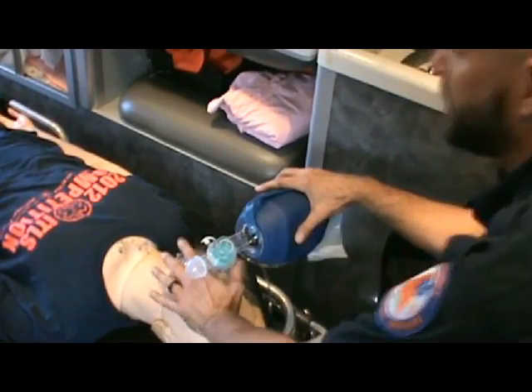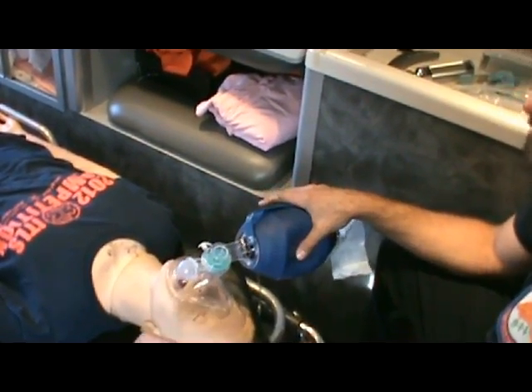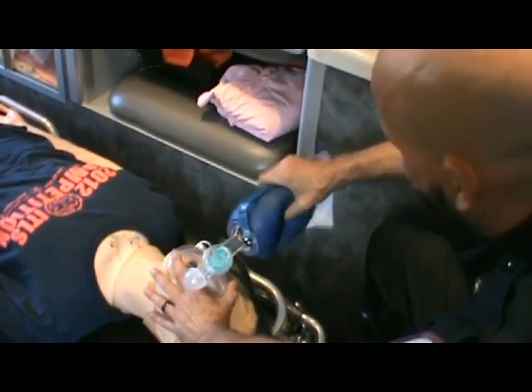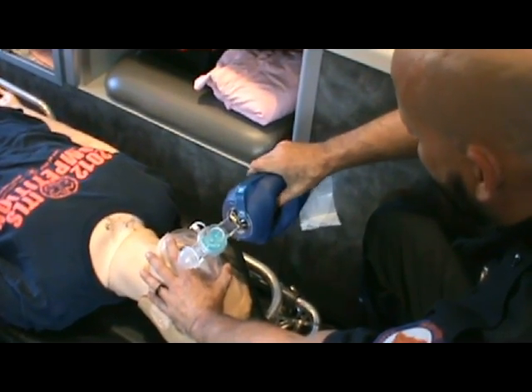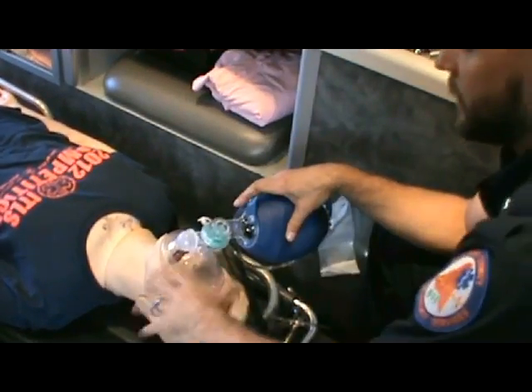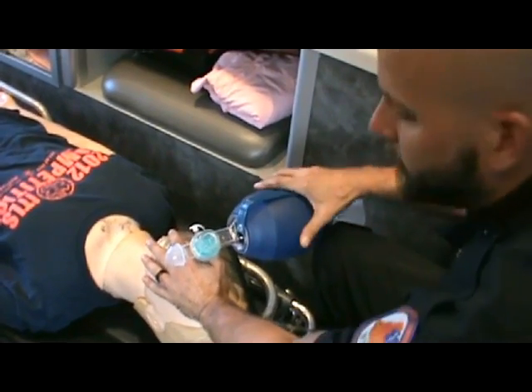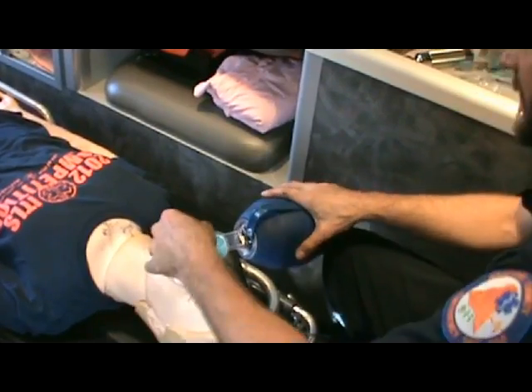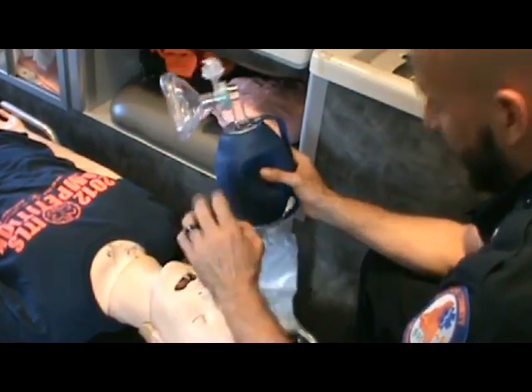You can bag for a good 45 minutes and not have to decompress the stomach if you keep these things in mind. The first way you fill up the stomach is through the forcefulness of each bag. If you do a nice squeeze and let it release, 99% of that air is going into the lungs. But if you squeeze hard and aggressively — nobody breathes like this, so why are we doing it to patients? That excess pressure in the hypopharynx is going to blow down into the stomach and fill it up.